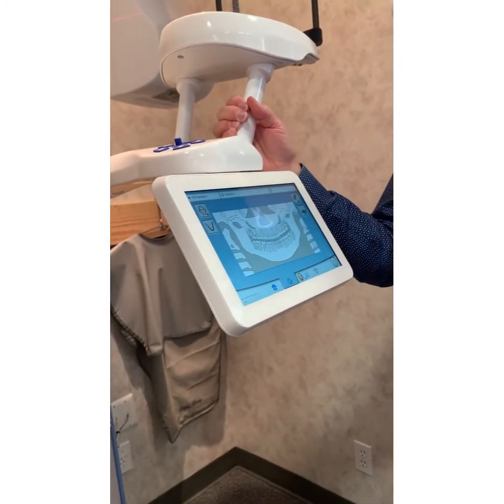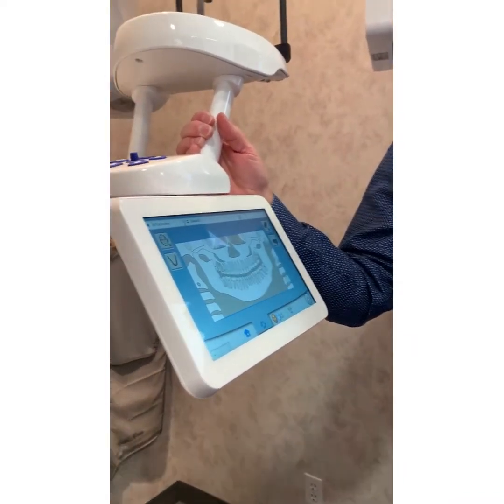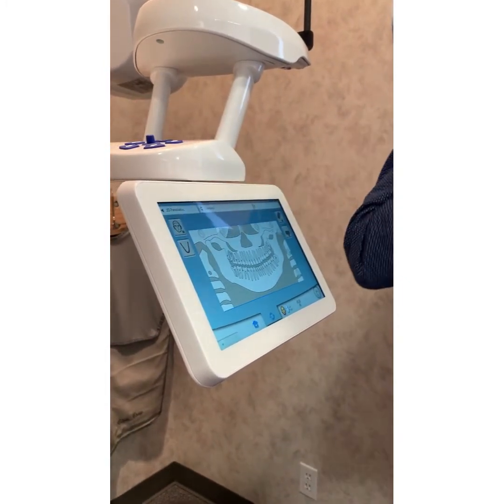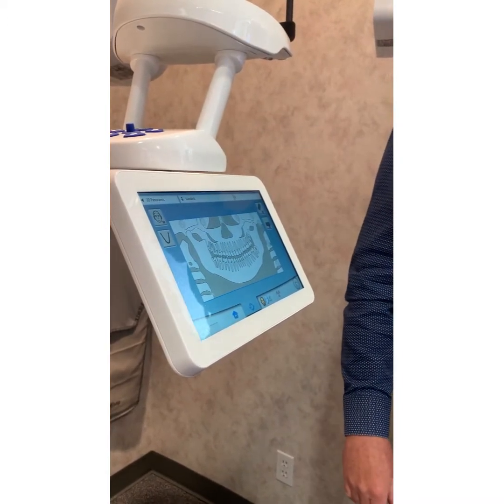Again, the same thing you guys did for pans before, you'll do now. What you hear from me might resonate with you; if I know all this, it's remedial. What I generally like to impart to anybody is that we still want 5 degrees down in this occlusal plane, centered in the machine, and this light right here needs to be between 10 and 11 on everybody, big and little ones.